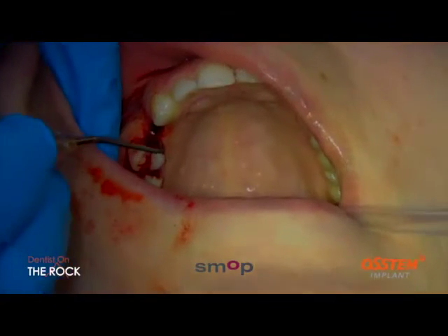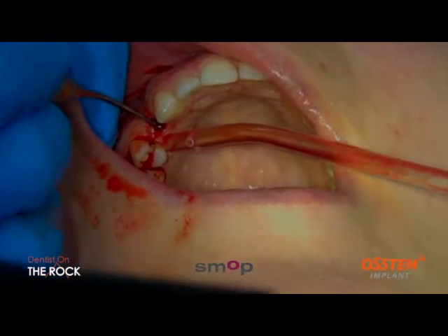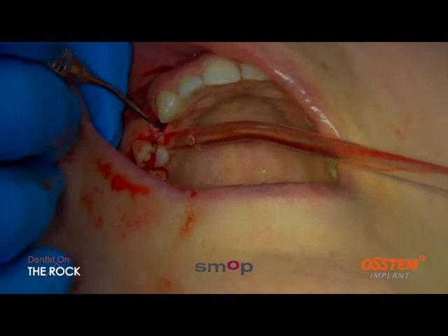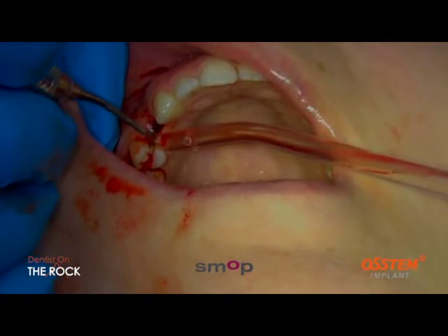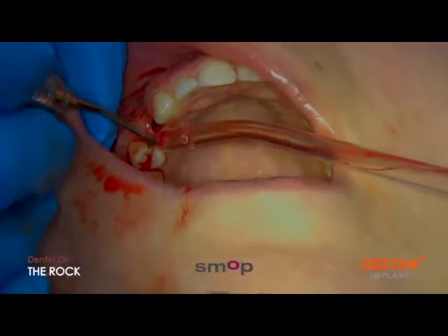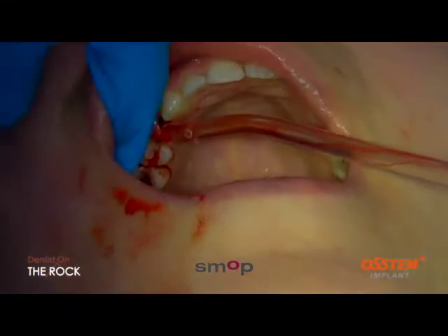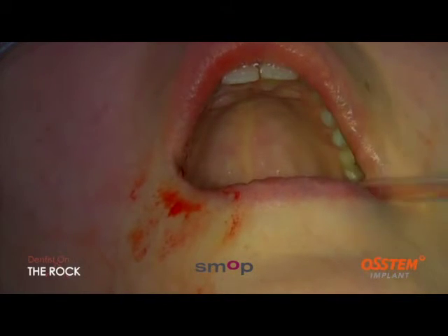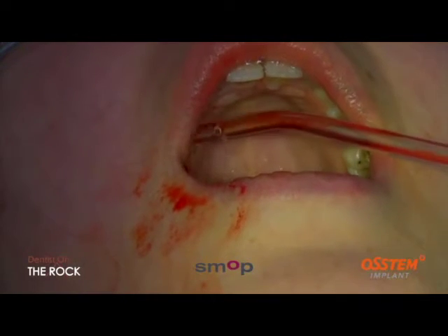So I'm checking again now. I've reached the full extent. I'm making sure that I've got no perforations, that the osteotomy is accurate, and it is. I want to make sure that I can feel the end of it, that there's no problems around any of the areas where I've prepared. And there's not. I'll be ready in a second.